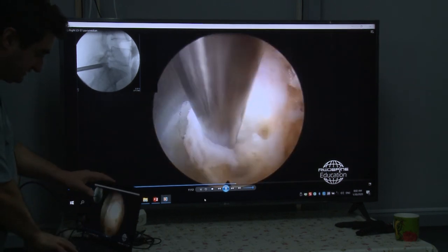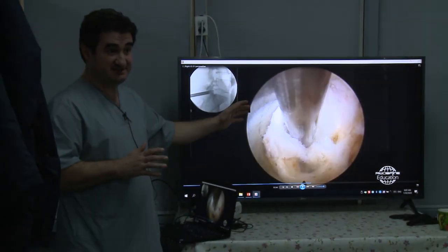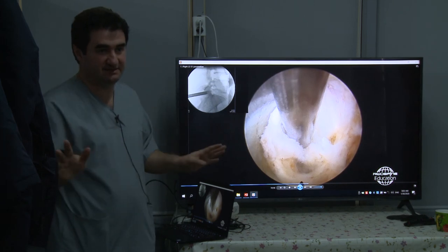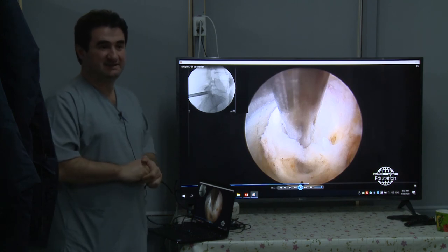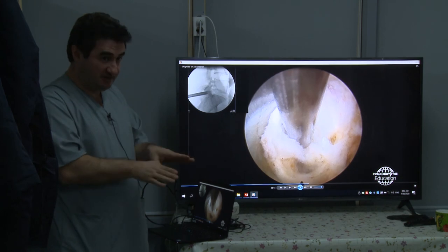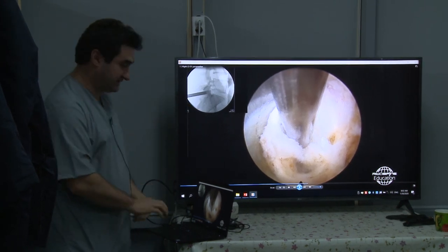You see, if you have a small herniation, then it's very easy with the big interlaminar. You know, just rotate, cut it, and take it out. That's enough. But if you have big herniations like this morning, then you have to work more. Yeah, that's why we always recommend you a big interlaminar window, L5 S1 always to start, and the small herniations like that.